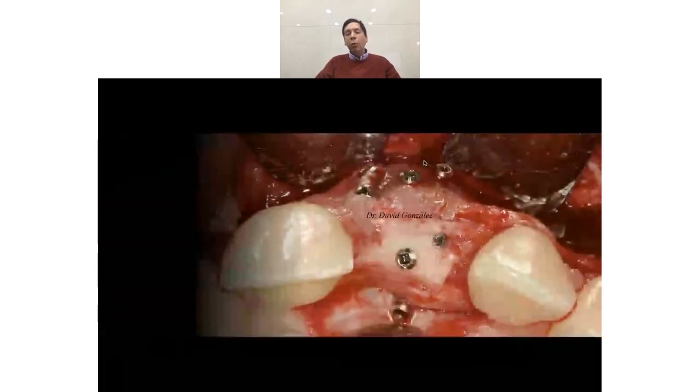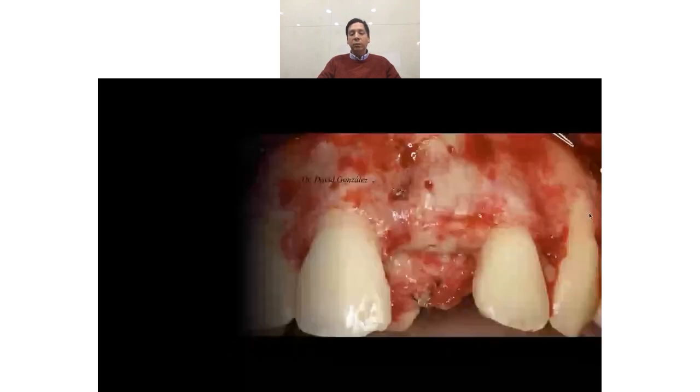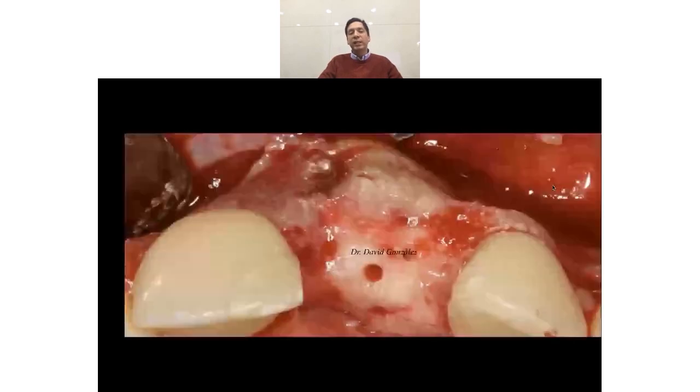And what is more satisfactory for me is seeing this. This is what satisfies me more, seeing this thick bone wall on the lateral incisor. So after removing the screws and seeing this big regeneration, now I will go for the implant, to place the implant. Another view. You can see vital bleeding bone, beautiful bone.